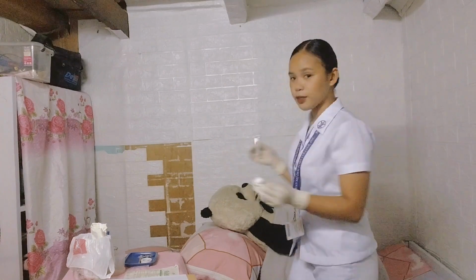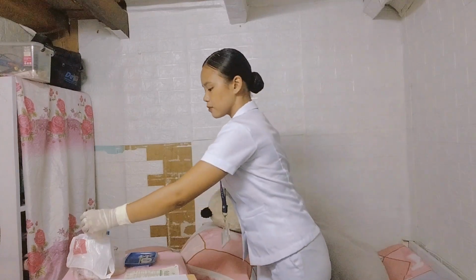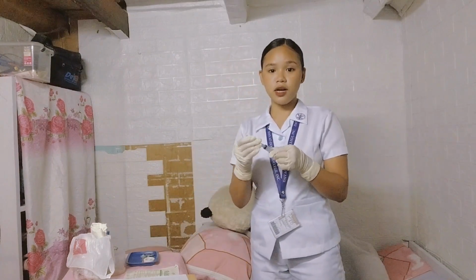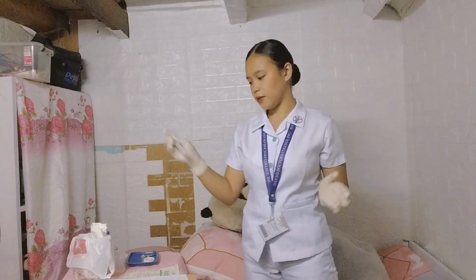After that, activate the needle safety device or discard the uncapped needle and attached syringe into the proper receptacle.